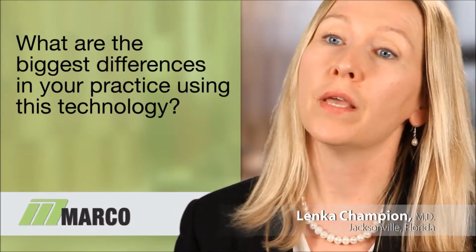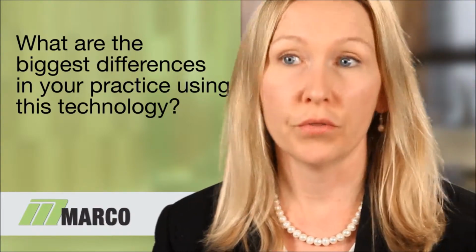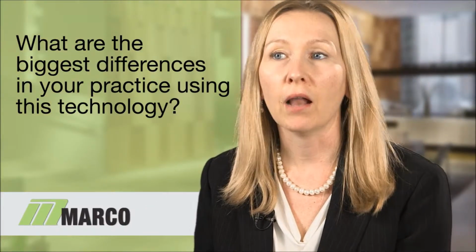Well, prior to OPD, in our toric patients, in their postoperative day 7, we used to dilate these patients and check their alignment of the toric IOL with the dilation. That's not always easy, because these patients sometimes don't dilate very well, and then they had to sit there for 45 minutes to get their pupils dilated.